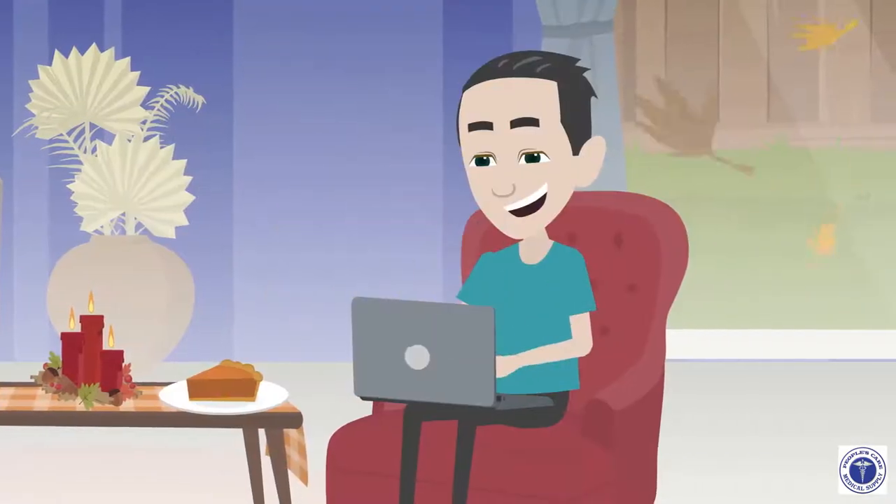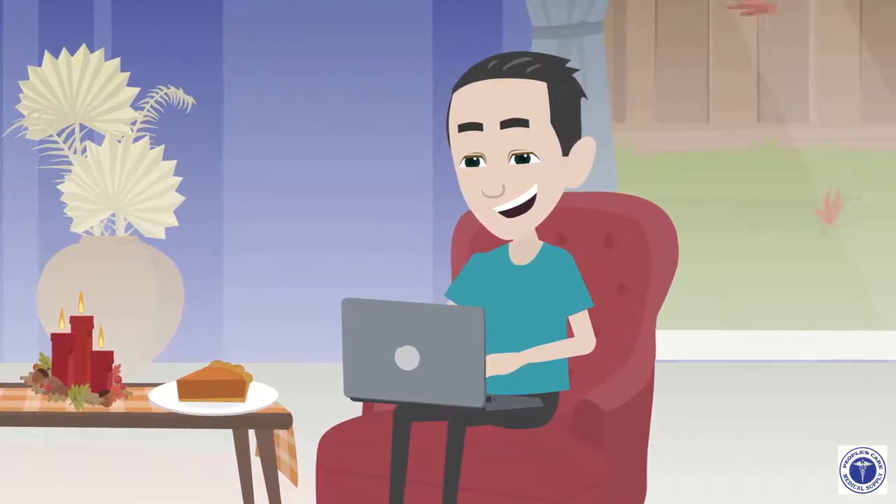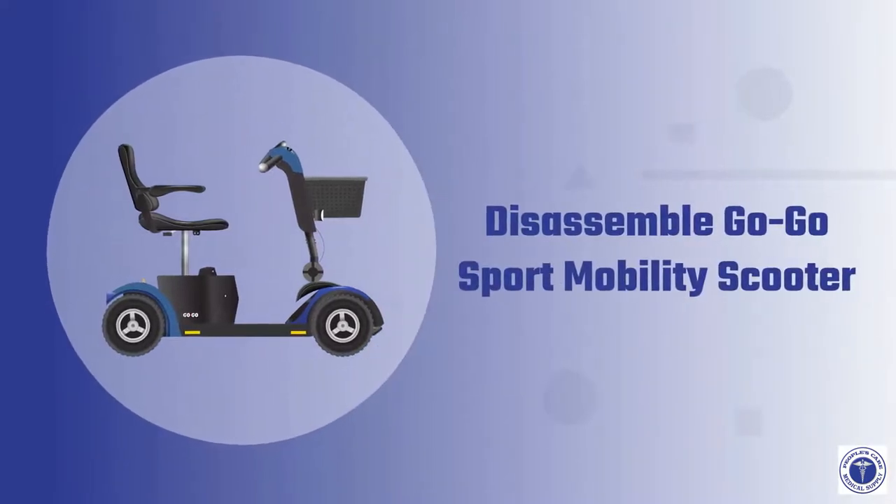The purpose of this video is to make your day an enjoyable and satisfactory experience when renting or buying our mobility products. Now, let's disassemble the GoGo Sport Mobility Scooter.